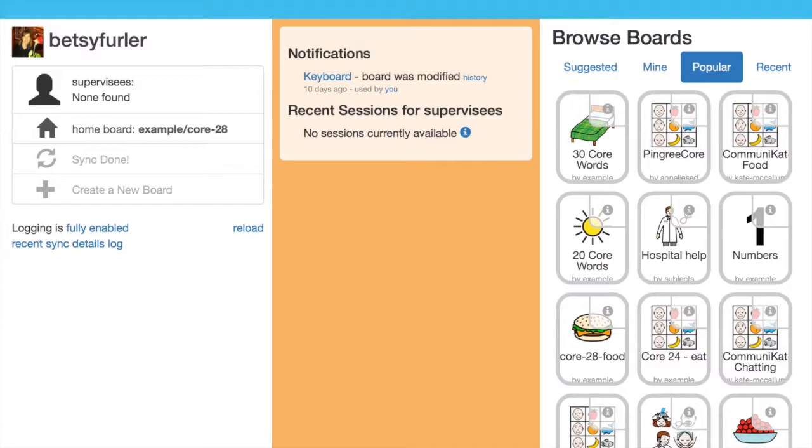called CoughDrop AAC. This is an augmentative communication app that helps people who are nonverbal or have verbal skills that aren't functional, or they're not able to verbalize as much as they can understand or think about. So this helps them speak. Again, it's called CoughDrop, and I've opened it up today to the dashboard. So this is the dashboard for CoughDrop.